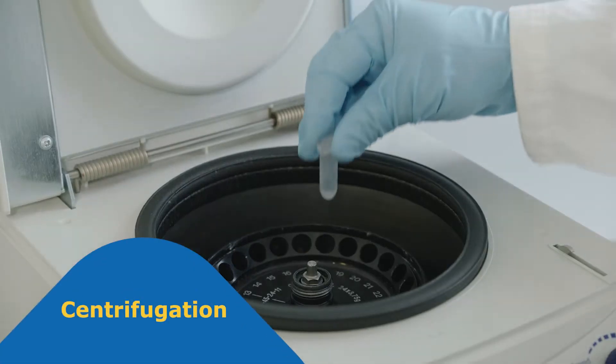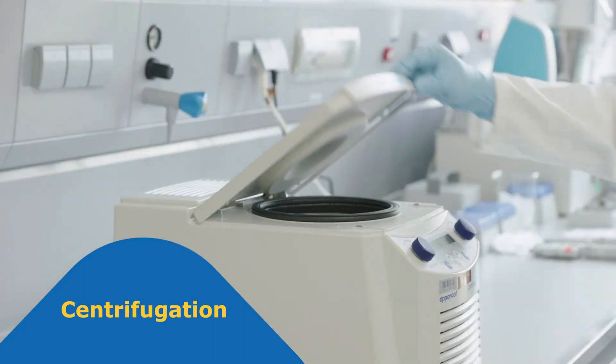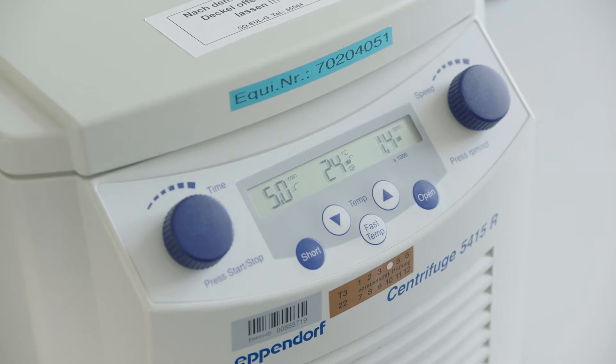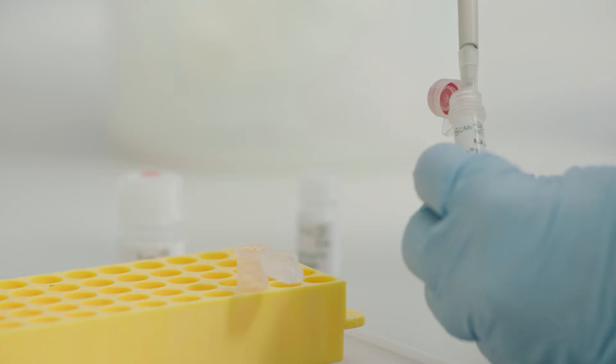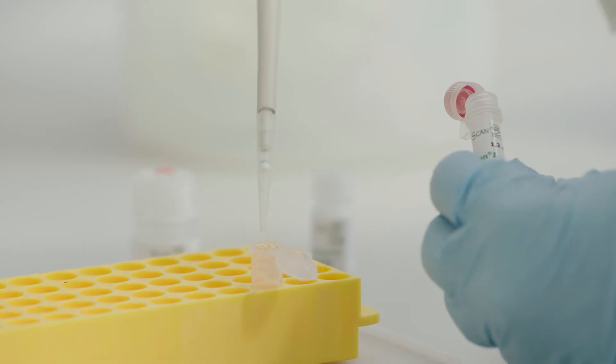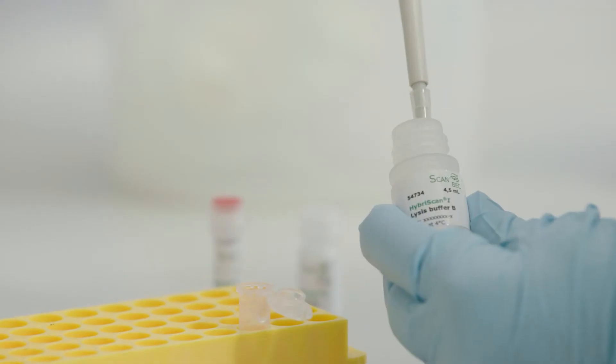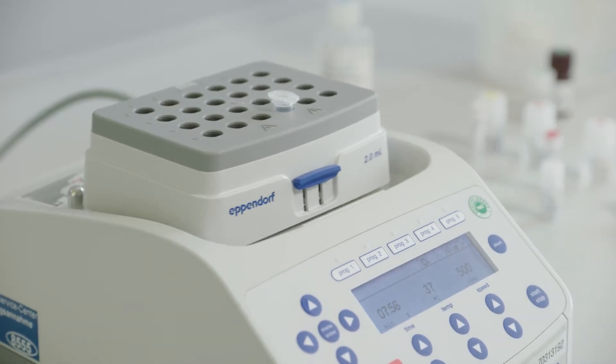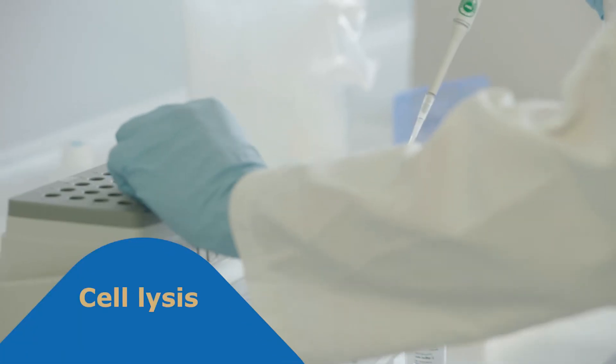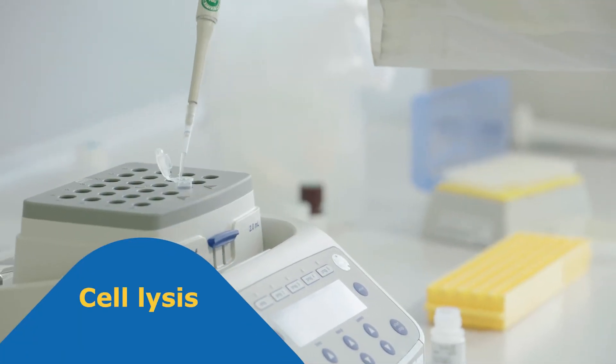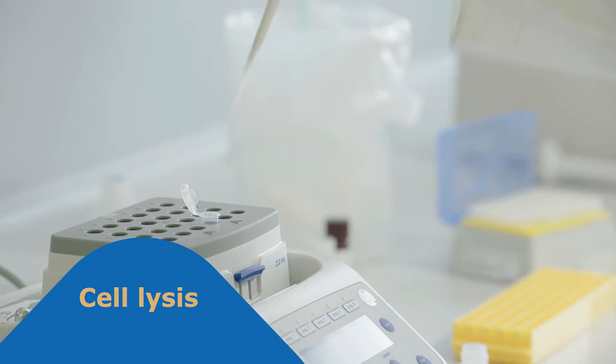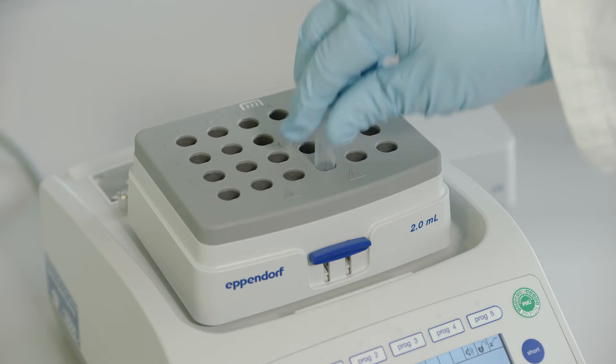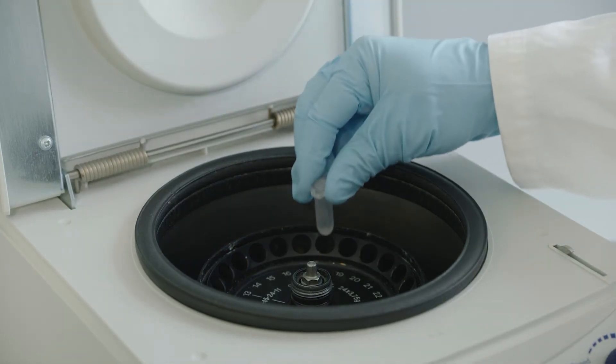The tube is centrifuged and the supernatant removed. Lysis buffer A and lysis reagent B are added to the pellet. The tubes are mixed and incubated for 15 minutes in a thermo shaker. Then a further lysis buffer is added, followed again by 15 minutes in the thermo shaker. The ribosomal RNA has now been released.